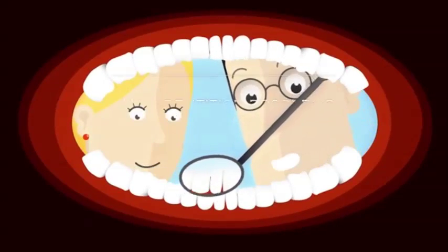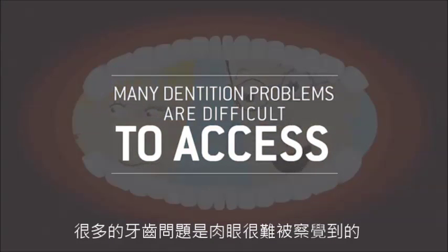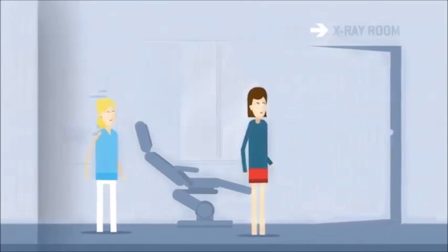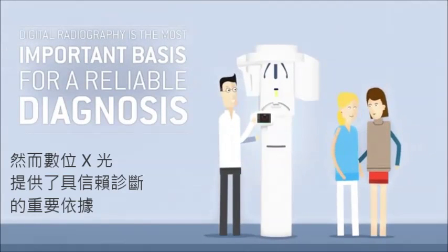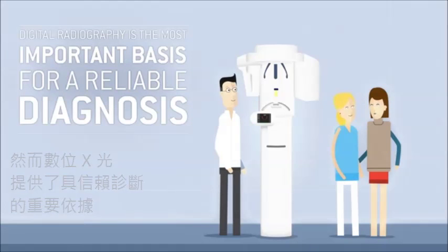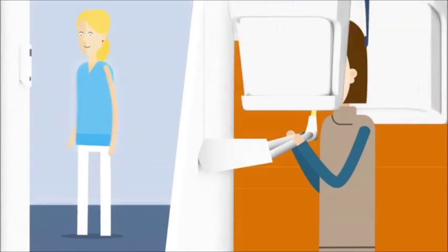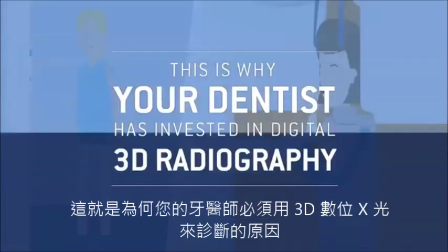Many dentition problems are difficult to access or are located below the surface. X-ray imaging, particularly low radiation digital imaging, is the most important basis for a reliable diagnosis in these cases. In order to enhance your dentist's ability to detect any hidden problems, he has invested in high quality digital technology: 3D radiography.